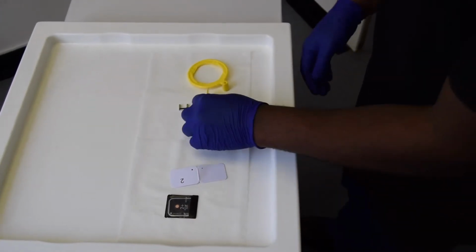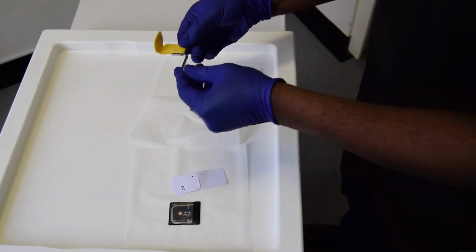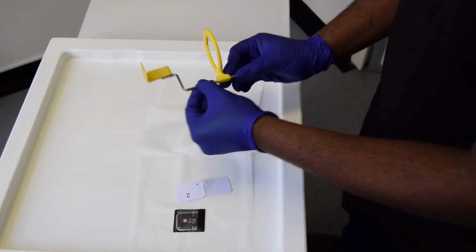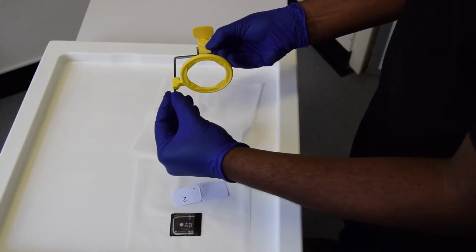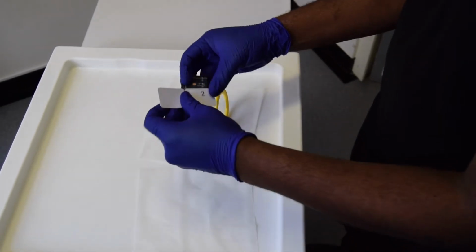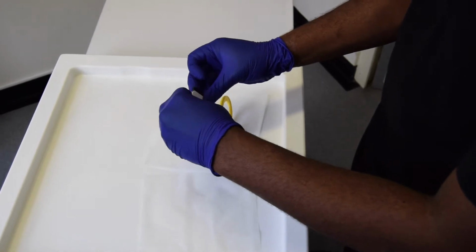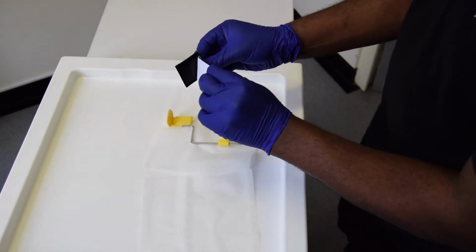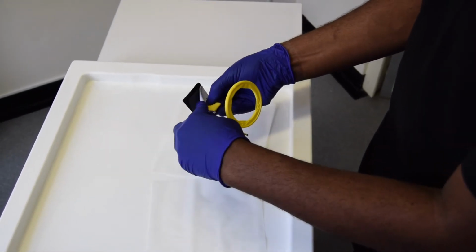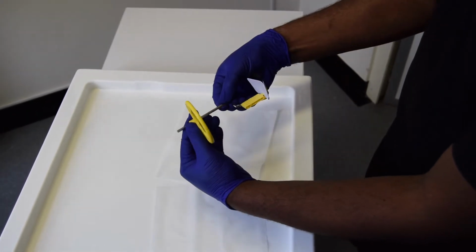In this case, we are assembling the yellow holders to look at the left upper quadrant. We hold the holder and then we attach the aiming indicator, and then we attach the ring. Once the holder is set up, we then pick up the image receptor, wrap a card around it, slot it into the holder, ensuring the blank side is facing the ray. We have a look through the hole, you can see the receptors in the middle.